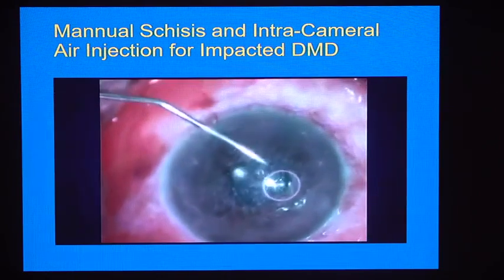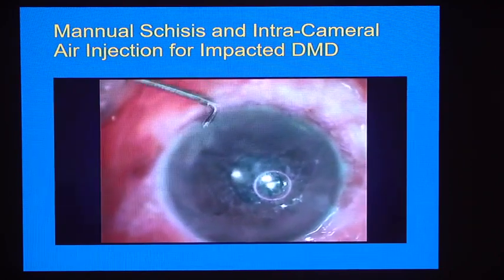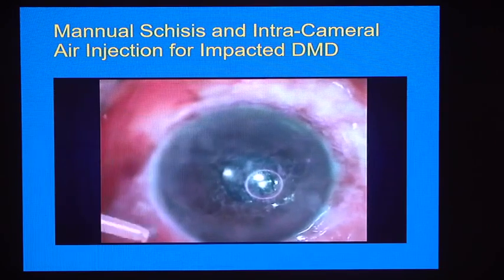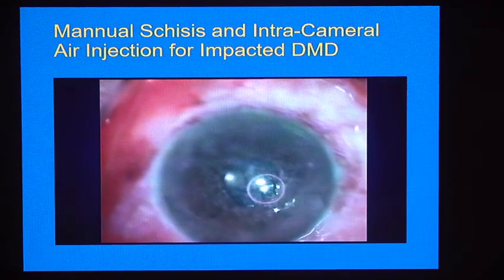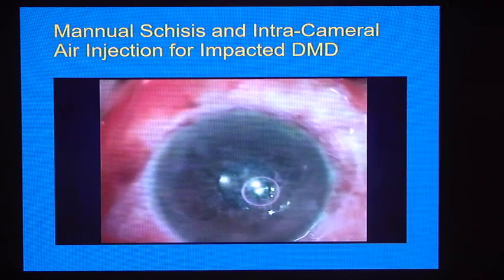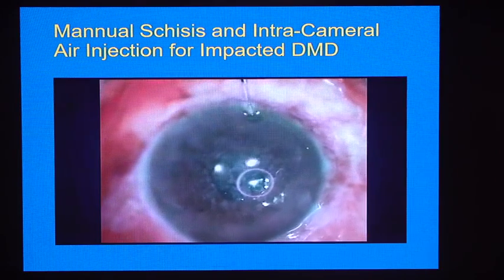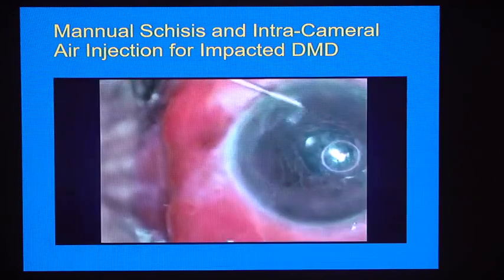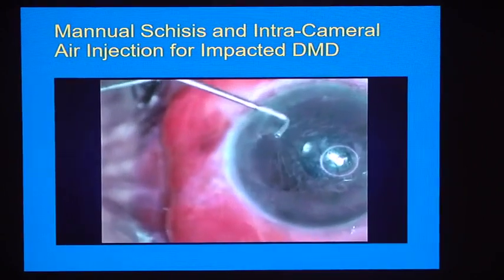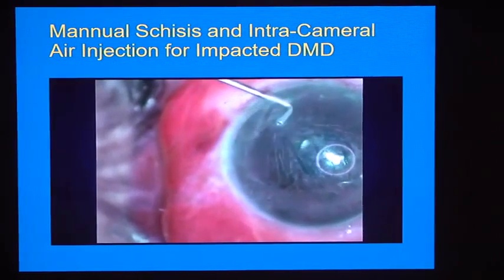This patient was sent to me after 2 months or so. That's the reason it has got impacted. So now when I pressed, you can see that we didn't see the upper border. So this ensured that the Descemet's membrane has got detached from the stuck area. Because the endothelial cells are in the environment where they usually are, we don't get so much endothelial cell damage, even in the chronic cases.